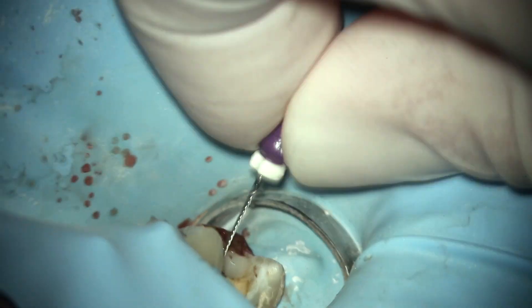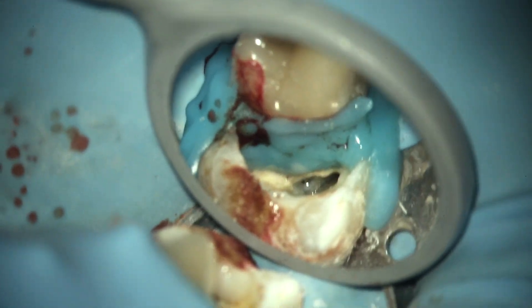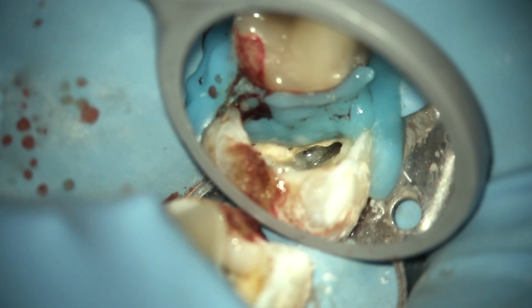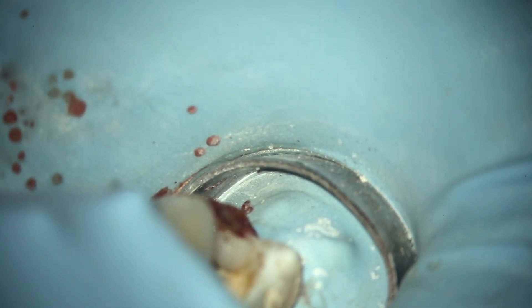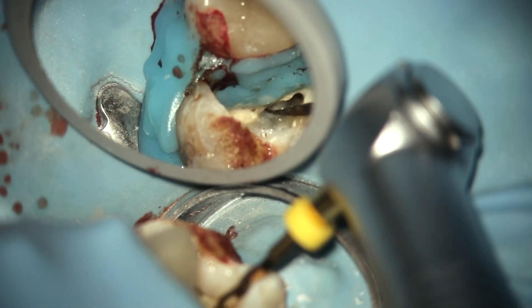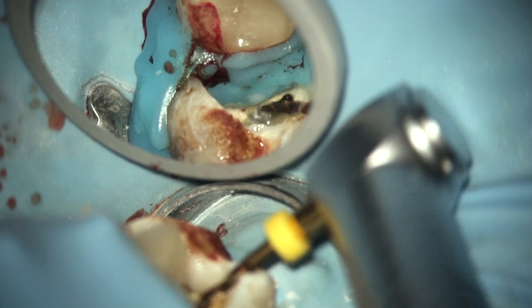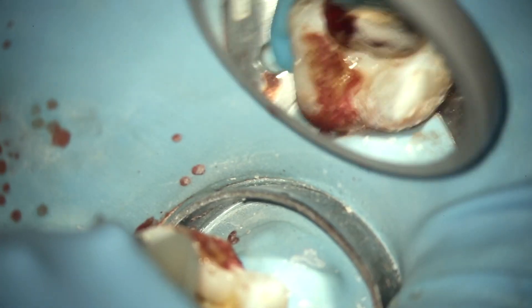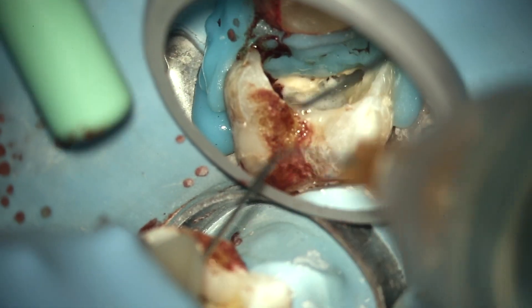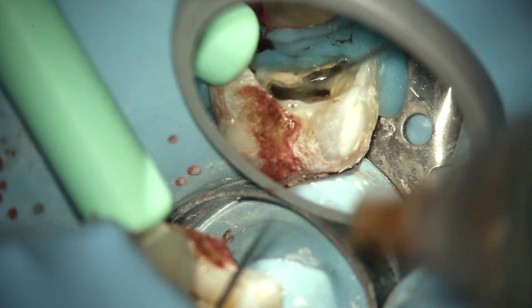Remember the MB, DB, palatal were really fast and wide open — look how tight this MB2 is. When they're tight you really have to get that loose 10c in there in the coronal third, about 10 millimeters down: that's the coronal negotiation, the first step in the RCT playbook. The second step is the coronal flare. I love the ProTaper Gold SX — it's gold wire, it doesn't separate as long as you do a 10c shorty first to get it loose, then brush four to five times to the outer wall without pushing apically.